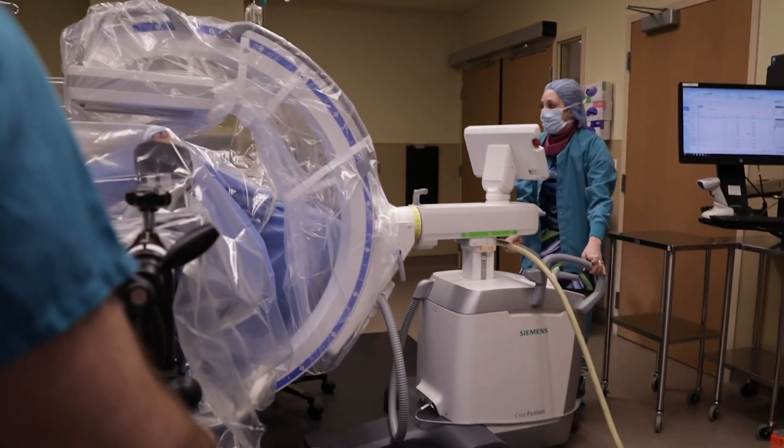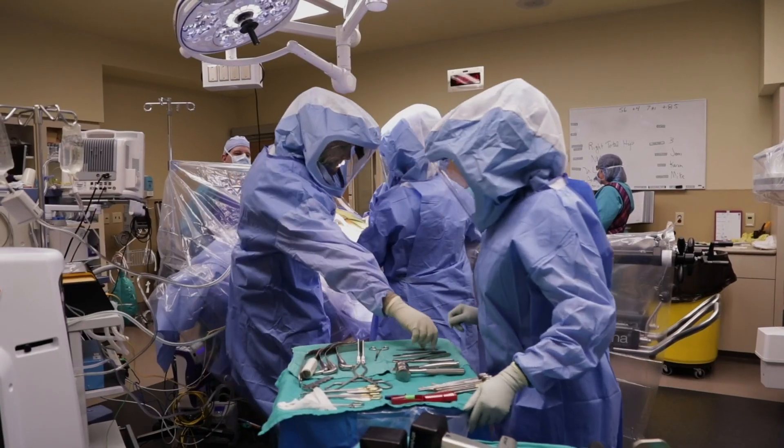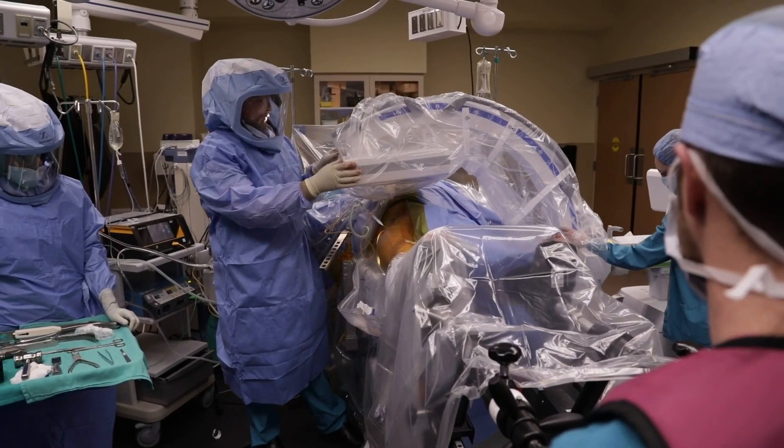The patient is positioned on an orthopedic HANA table. The C-arm is brought in on the opposite side of the surgeon. Surgery begins, the surgeon performs the exposure and is ready for the femoral neck cut. The C-arm is brought into position.